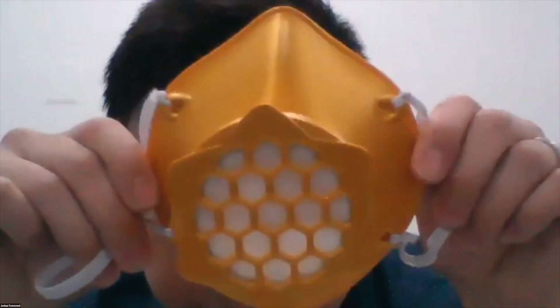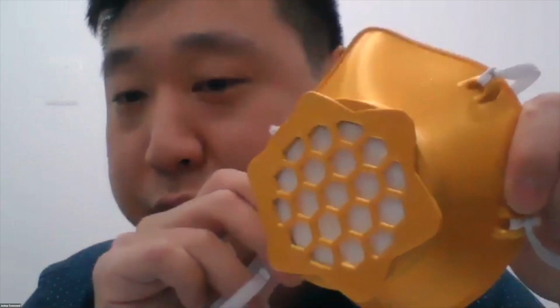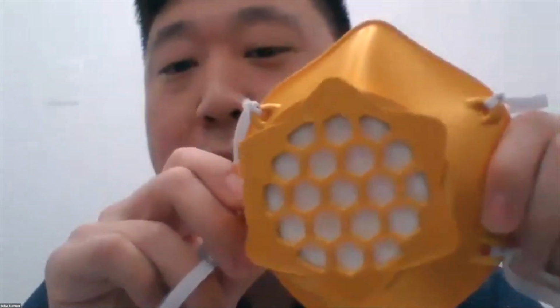Now, finally, we came on to our final design of the mask. What it came down to was the fact that simplicity was key. We didn't need it to look so aesthetic at the same time. It just needed to be functional, right? So I actually printed this out on my hobby printer out of a silk gold PLA. And this is just more for aesthetic appeal. But you can see that it offers a larger opening. So, you know, you could breathe properly and exhale properly.